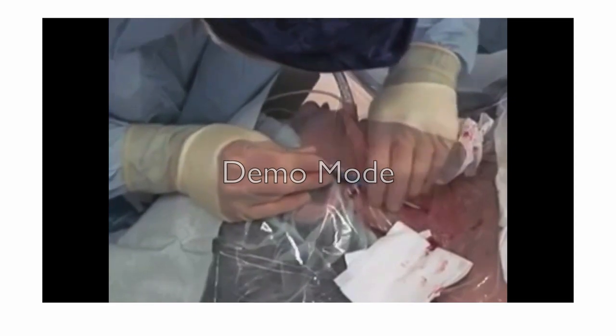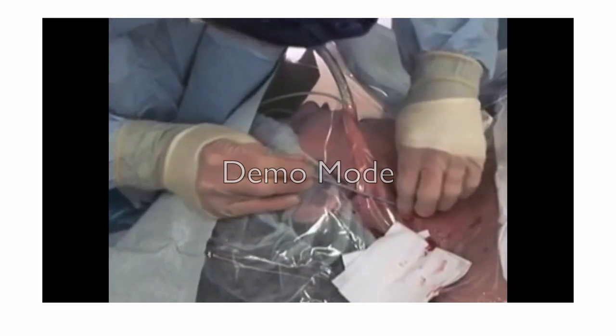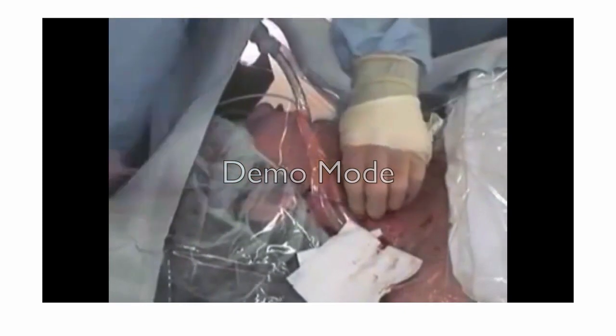Twist the dilator in and push it inside to dilate the skin and the underneath subcutaneous tissues. Once you are happy with the dilatation, take the dilator out, and sometimes you can apply some gauze on the bleeding site just to control the bleeding.